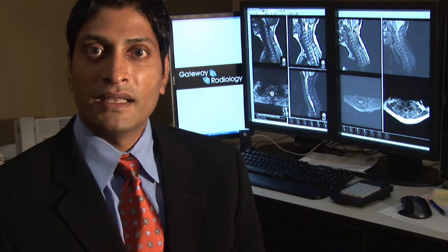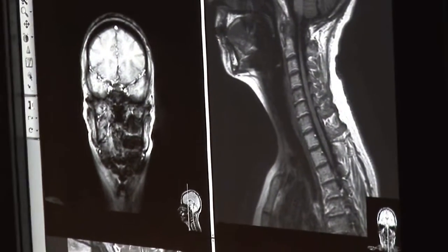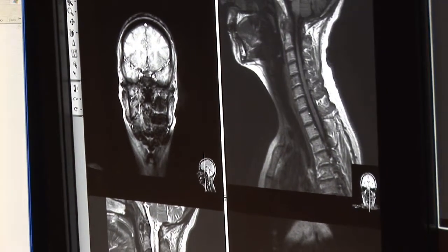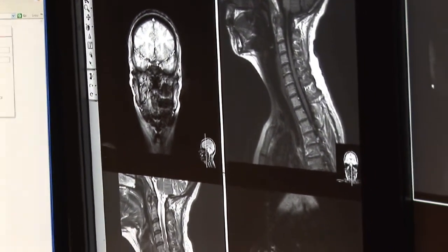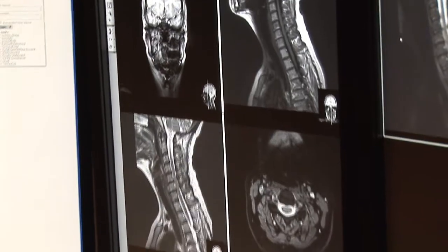Once that information is put on the imaging plate, the imaging plate is then put in a processor where that data can be processed and generated into the image, which can then be transmitted to a workstation such as the one behind me. And that allows me to interpret the exam that was performed using computed radiography.